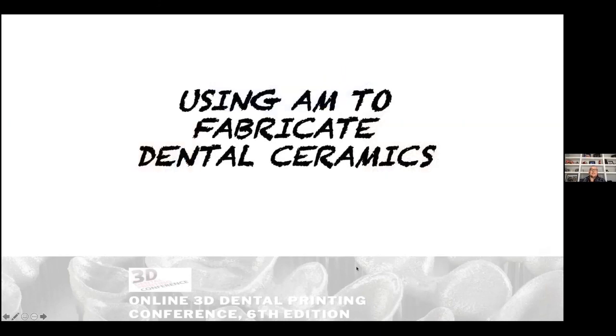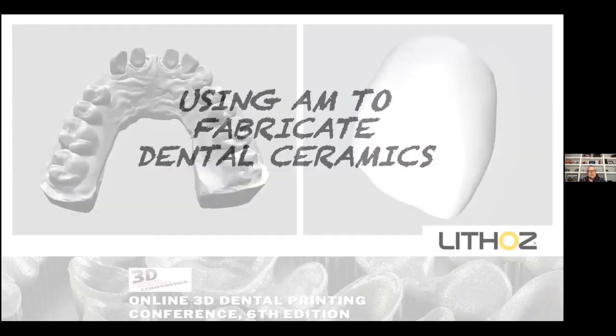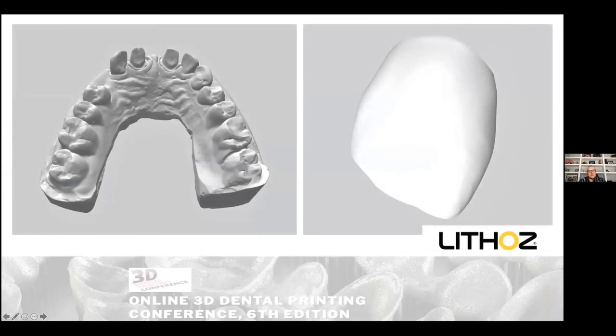Well, at the very beginning of the introduction, I mentioned metals and ceramics, and we have not touched on ceramics at all. So let's jump in there a little bit. So if a patient comes in, and this is a digitized model, we can see that the two front teeth have already been prepped. Yes, they're missing a tooth, but please disregard this. If we have to create restorations to fit over here, we still have a workflow of digitization and milling. Is it possible to 3D print those restorations?